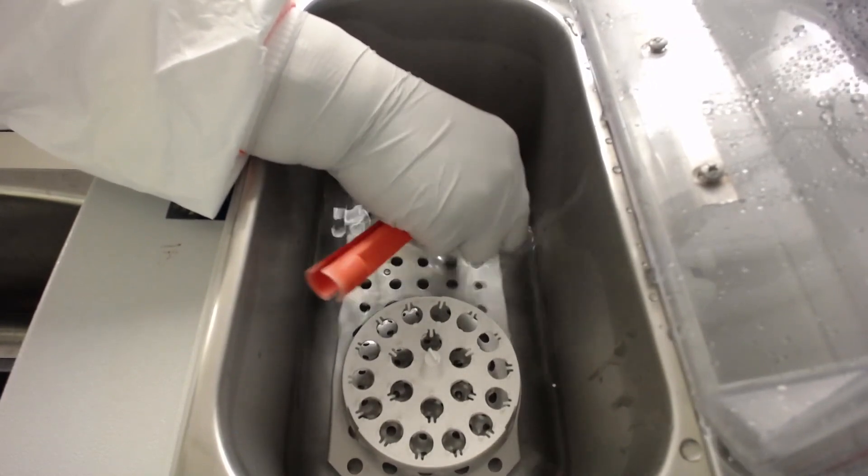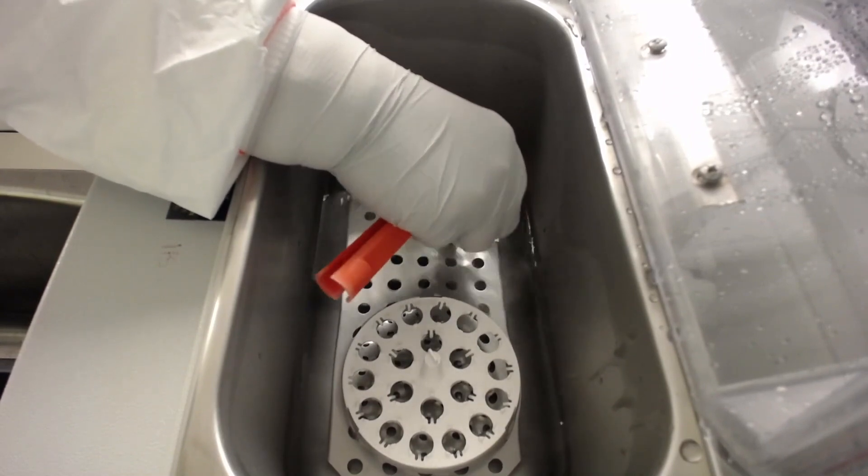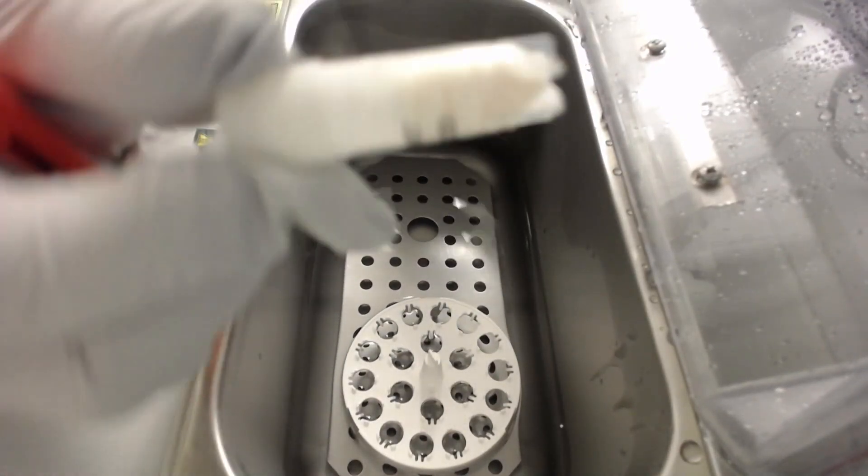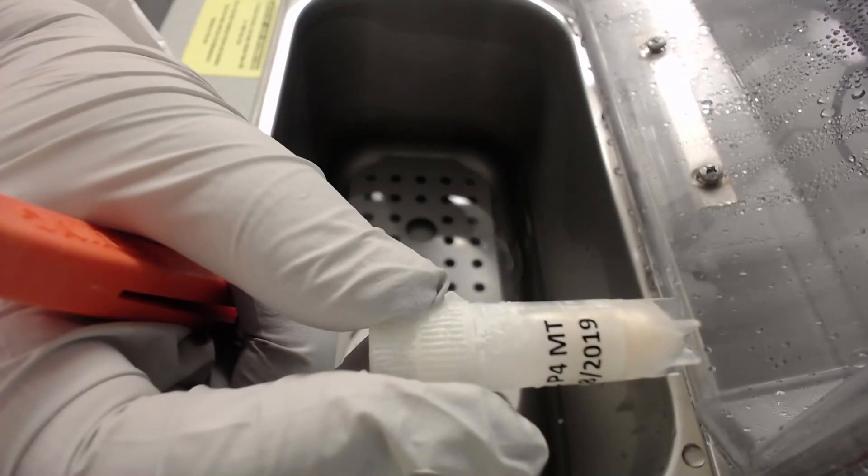Immerse the vial in the warm water and keep agitating it. The frozen cell pellet will thaw gradually. Check every 30 seconds to see how much ice is left. You might need to repeat this procedure a couple of times.